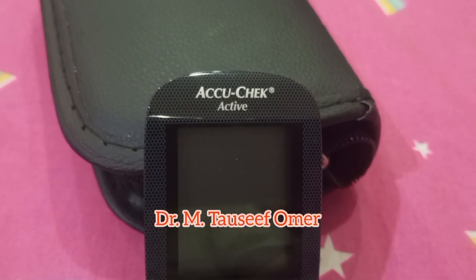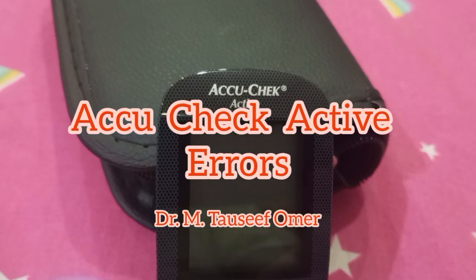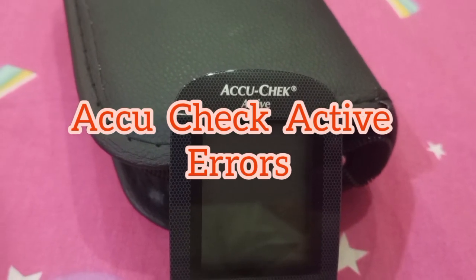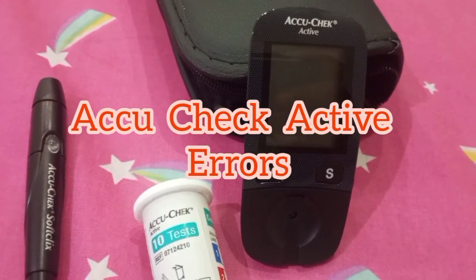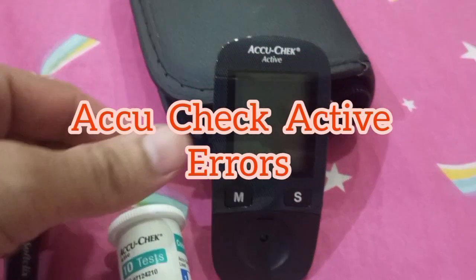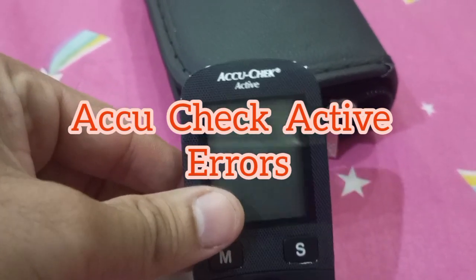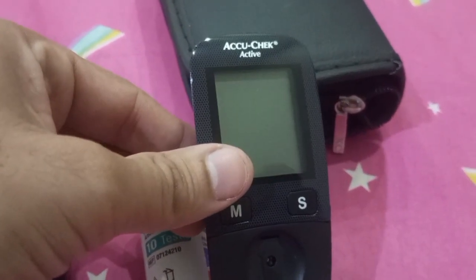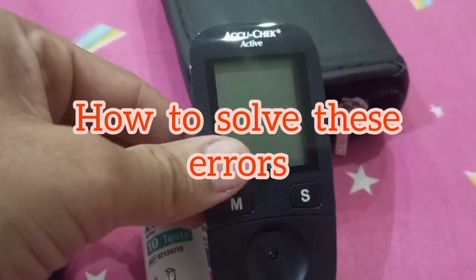Hello, I am Dr. Tawseef Umar. I hope you are doing well. If you or your loved one is suffering from diabetes or pre-diabetes, here in this short video we will have a summarized review of the errors on the Accu-Chek Active glucometer. We will also see what to do in case you encounter an error message.